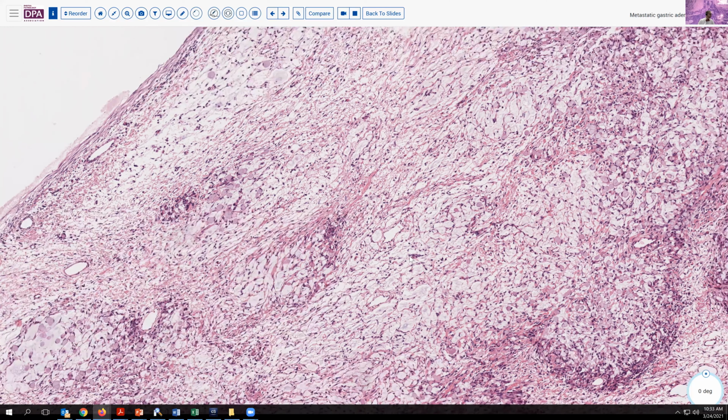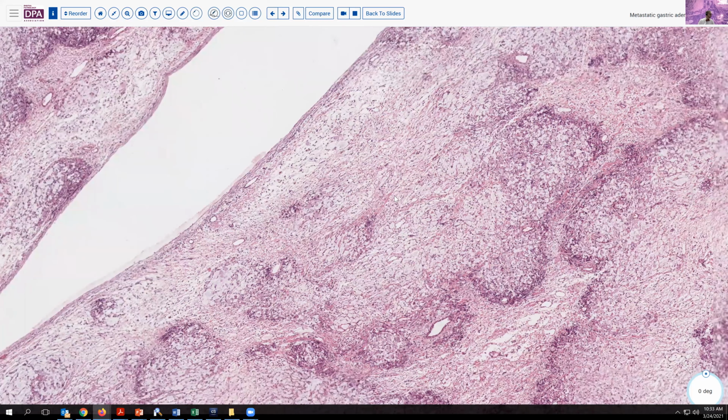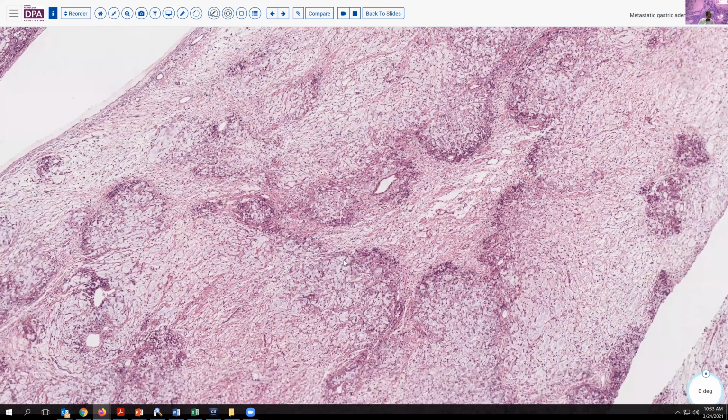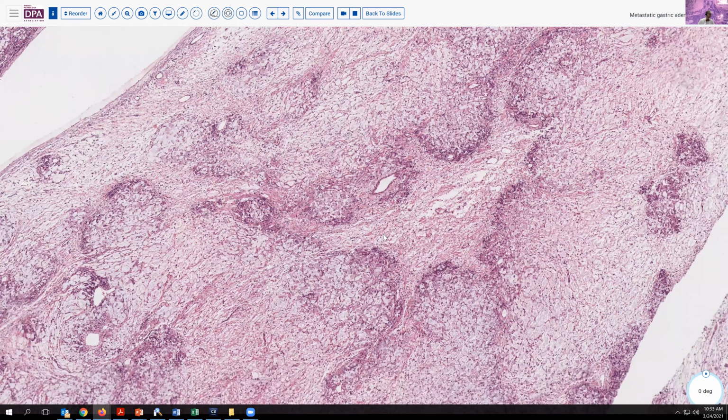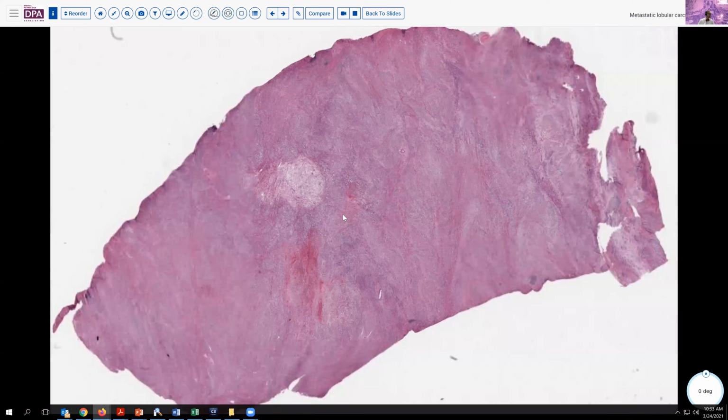So this pattern of dissecting mucinosis or pseudomyxoma ovarii can also be a pattern somewhat resembling the other lesions that can occur in the ovary. So let's go on to a different, well, no, actually, we've dealt with the gastrointestinal lesions. Let's see how other tumors might also produce this pattern.